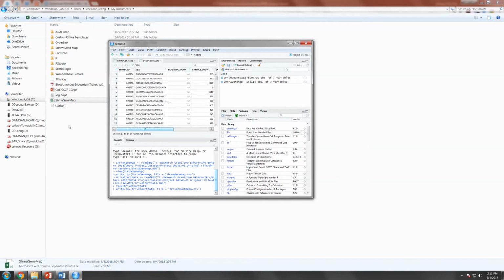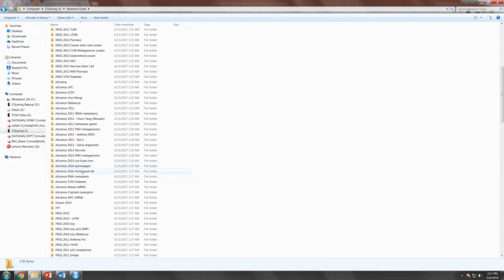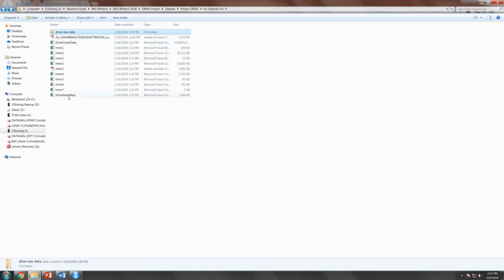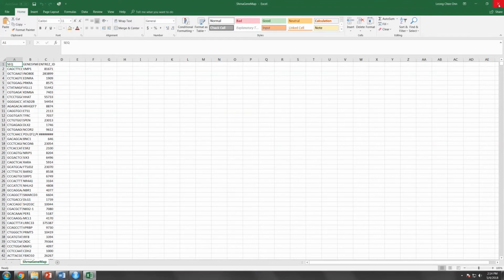Now for the ease of discussion and also the ease of time, I'm going to show you what has been converted. I will come back to the files that I have already converted beforehand, to show you how they look. Come back here again. You can see this is the file that I converted previously. If I click on this one, you can see the exported file as I mentioned just now.